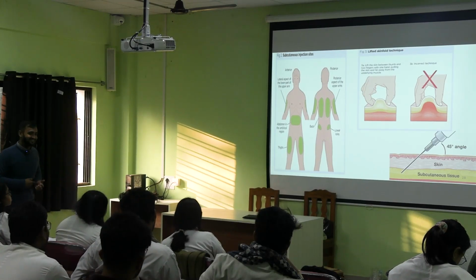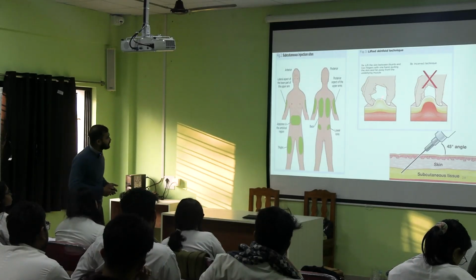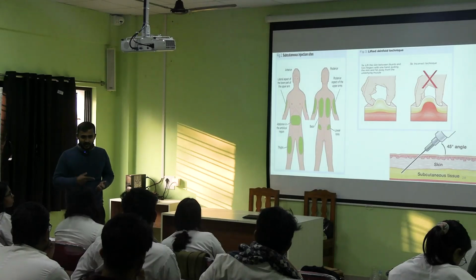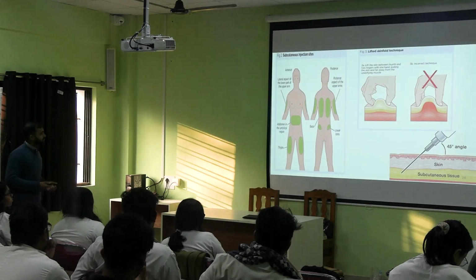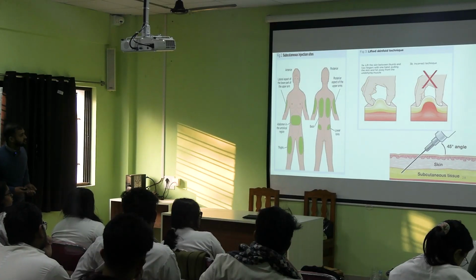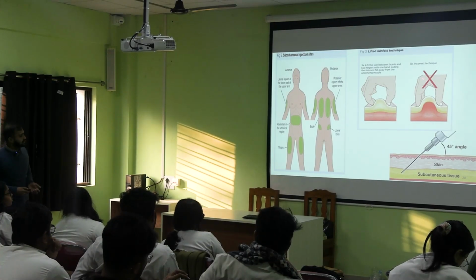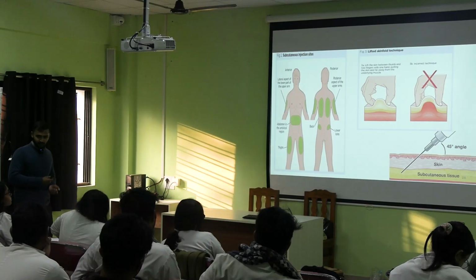It also seals. So what is the advantage? When you pull the skin, you are giving more surface area for the injection, so there is less chance of intramuscular penetration. Your pinch shouldn't be too big. It should be a little less, around 1 inch, so that it doesn't go too deep and the muscle comes up.